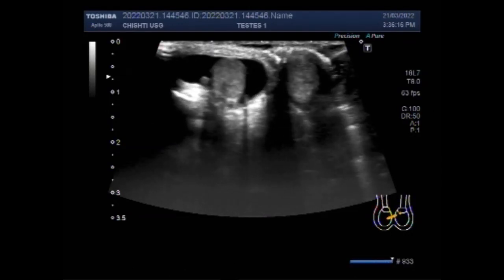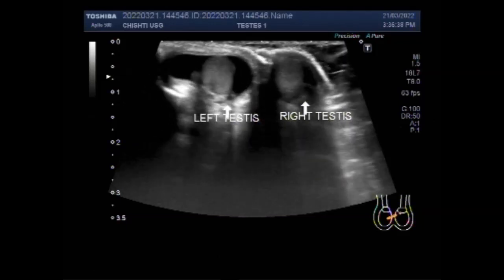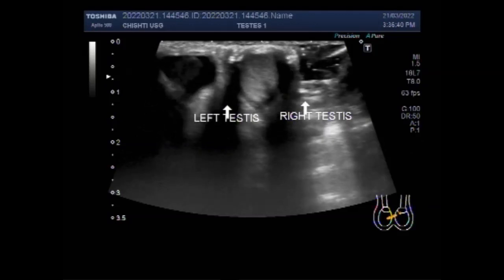You can see the scanning of the testes — this is the right testis and it looks echogenically normal, while the left testicle is surrounded by a fluid hydrocele on the left side.